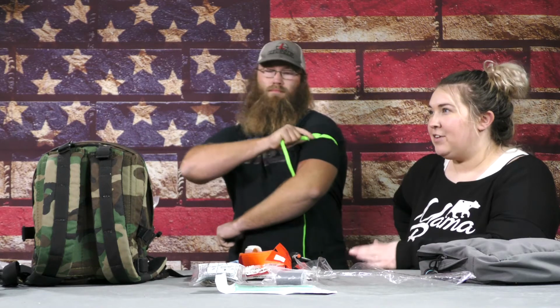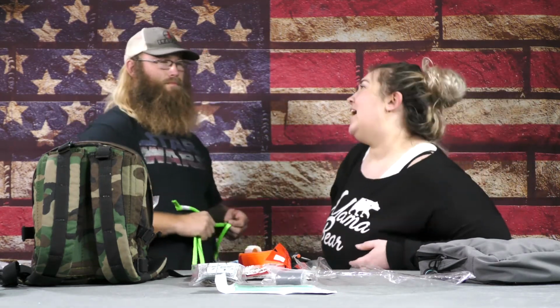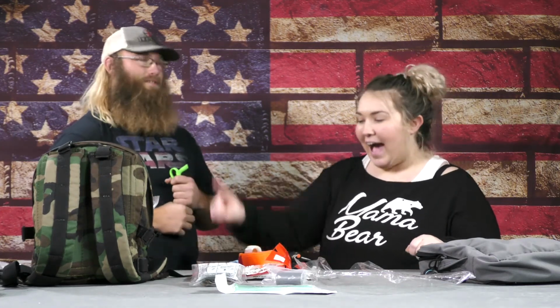The way I practice myself is I go, okay, this is practice. This is just a drill. I am not in any real danger. I am now going to take off my own tourniquet, and then I take it off. It is important that you say every word every single time, and don't let yourself have an out. Not, okay, I'm tired, I don't feel like walking to the cabinet. No, that's the only place that you're allowed to take it off, after you say it. You cannot slip up on that if you're training by yourself. And if you have someone there, have them take it off for you.